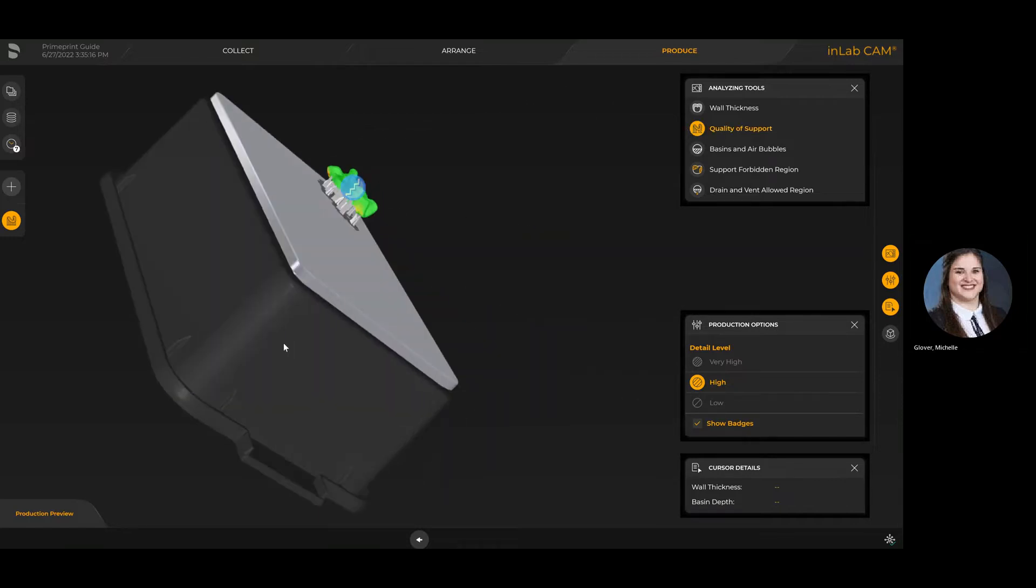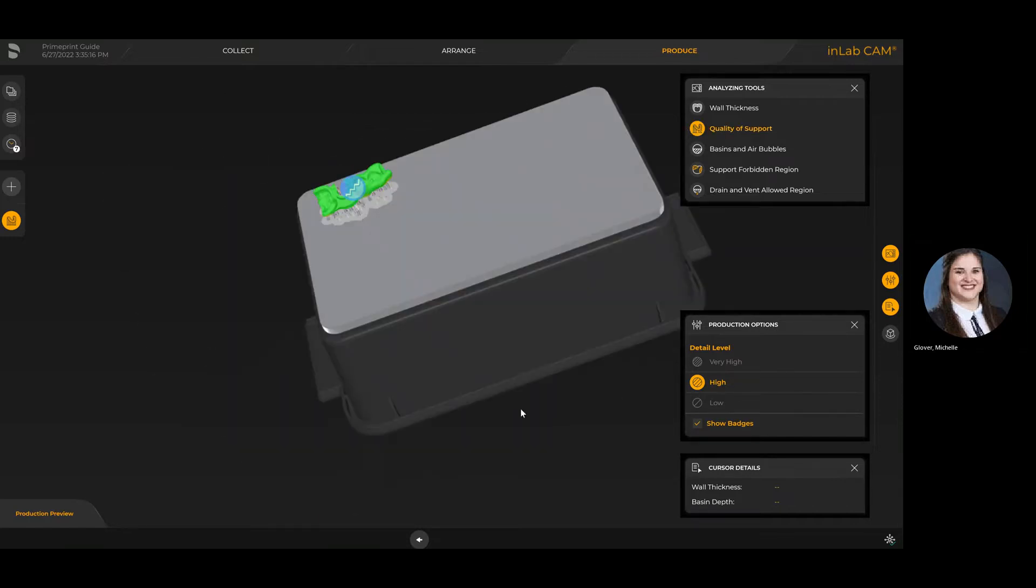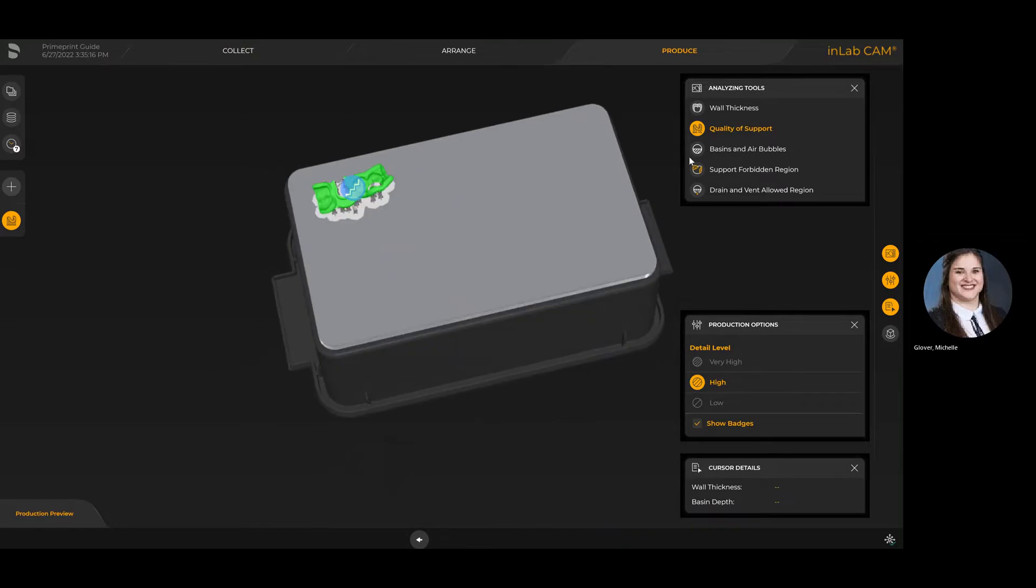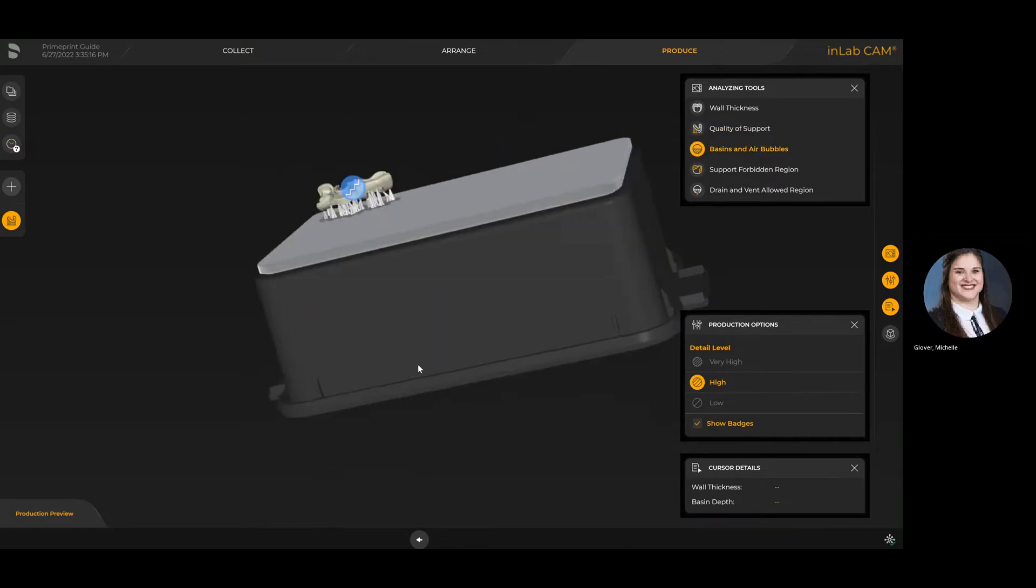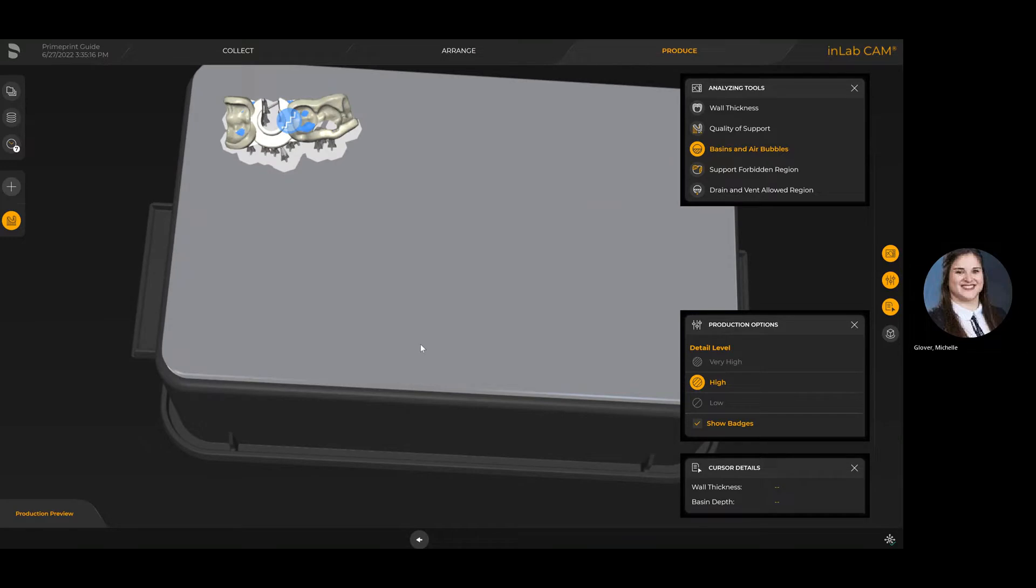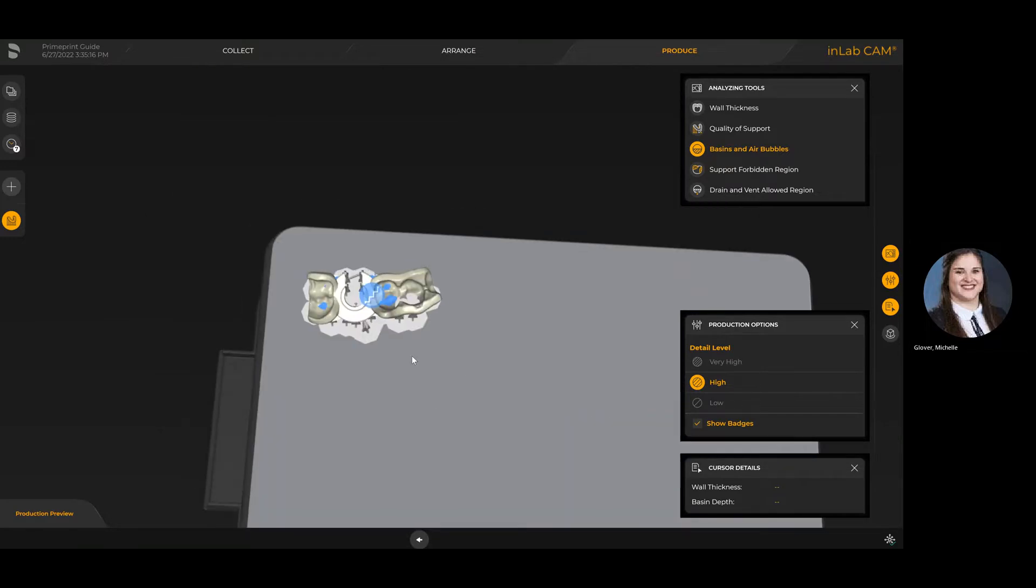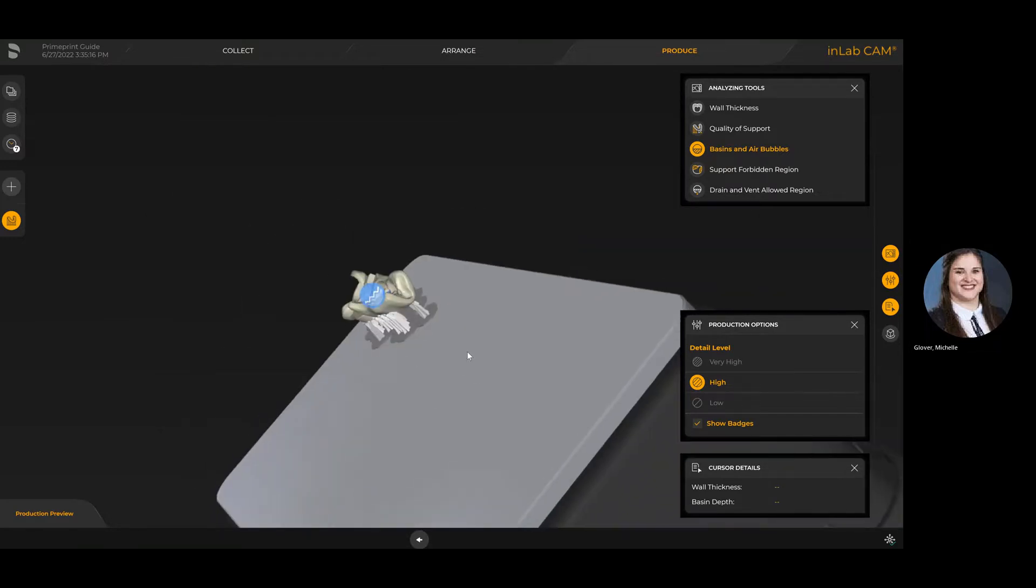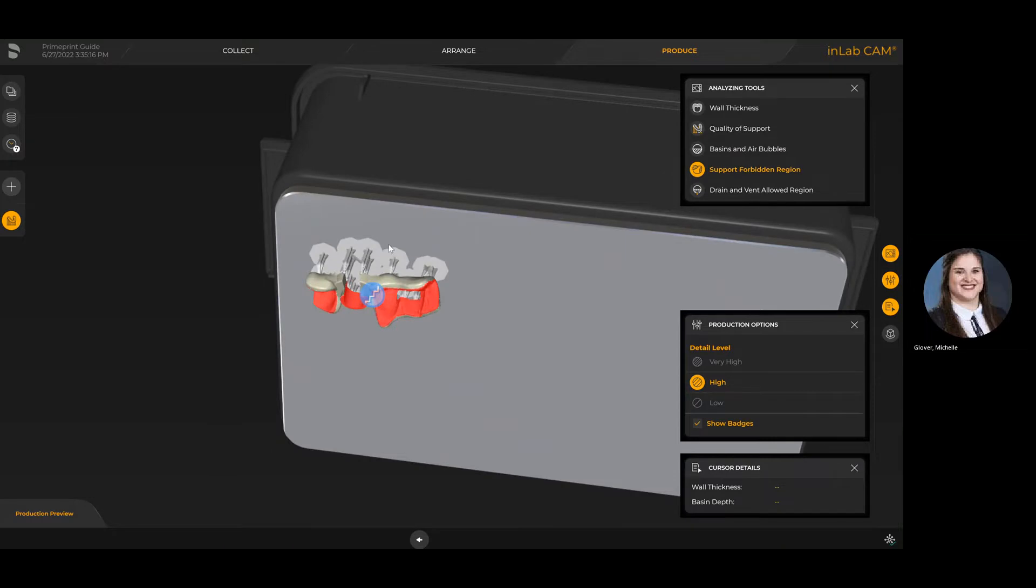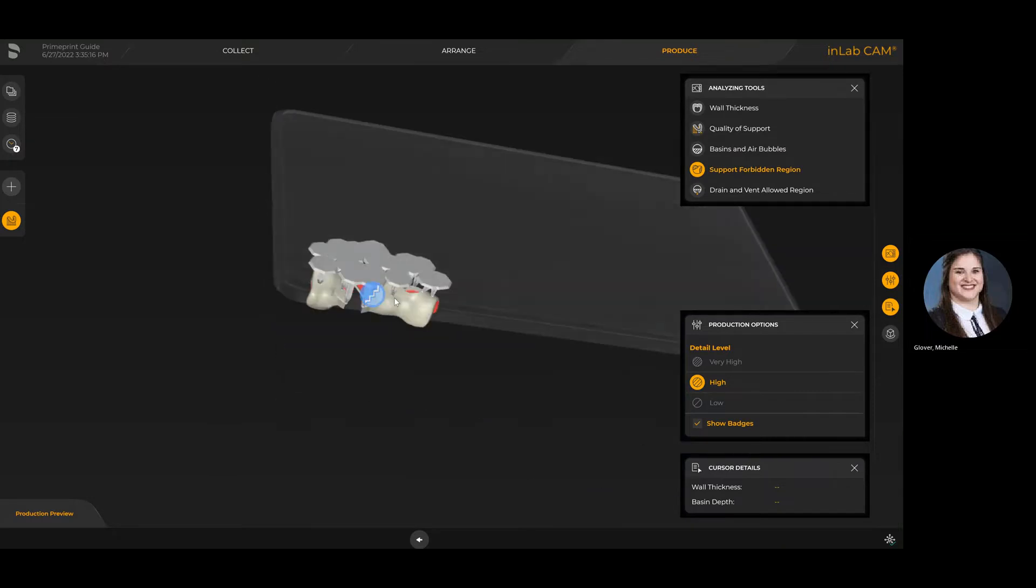Here I've got several analyzing tools where I can see the quality of the supports that the system has automatically placed for me. I can look at air bubbles or any basins that might collect more residue from a washing and curing perspective.